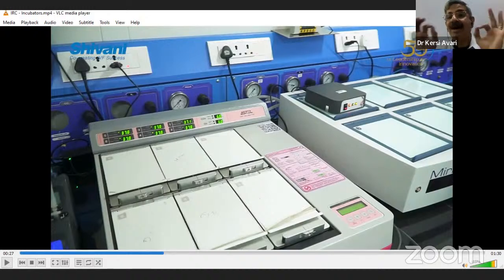So this is lab care. It's a gadget, of course costly, but even if you are abroad, scientists in the US can monitor from India what the condition of the lab, of the incubator in the lab is. But as I said, it all depends upon powerful connectivity, electronics, and price factor.